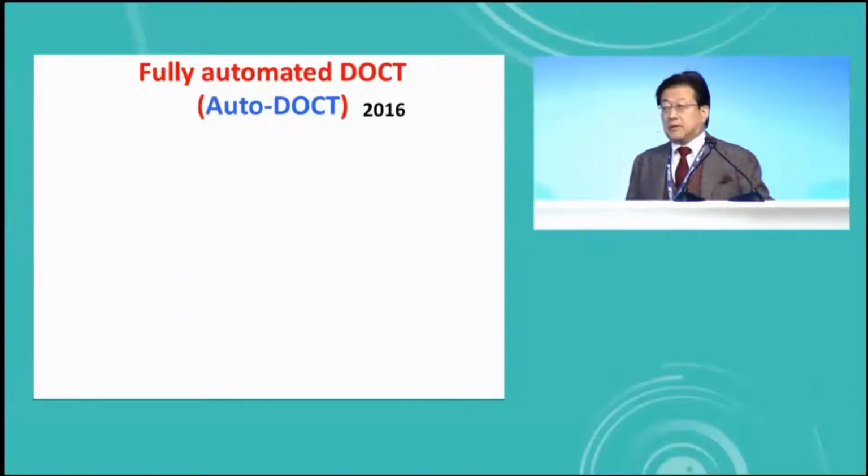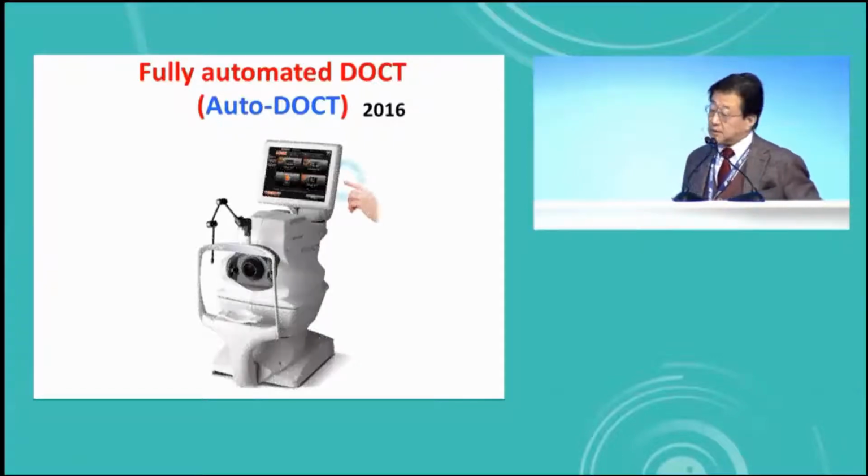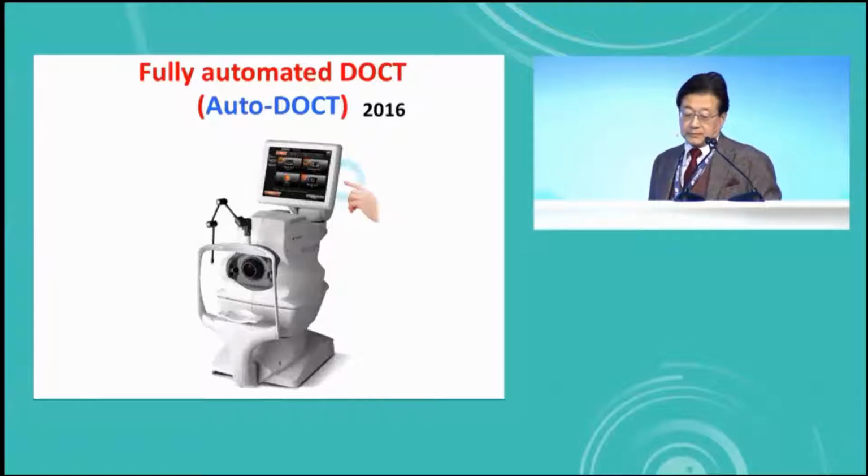Now, very recently, in 2016, we developed fully automated Doppler OCT, Auto DOCT. This is the one. Everything is automatic.